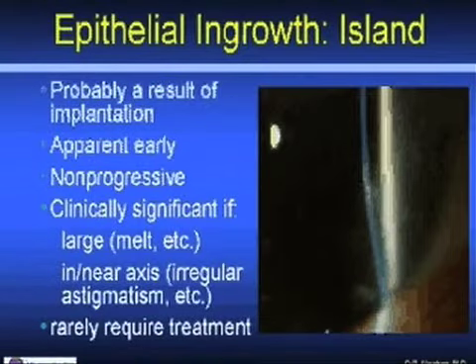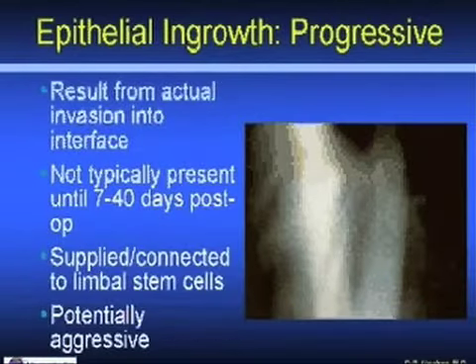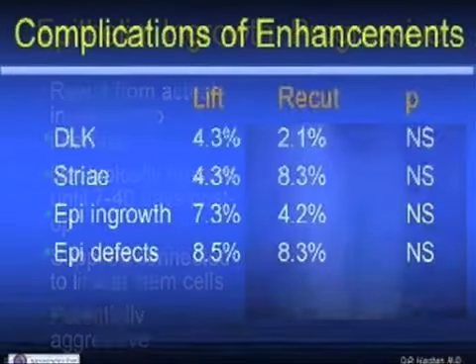Epithelial ingrowth, if we approach it early on, oftentimes is not much of a clinical problem, and again stays limited to the periphery in many patients and doesn't even require removal in some of those patients. In some, though, it's progressive and then eventually requires removal, and I tend to remove the epithelial ingrowth when it reaches the point that it encounters about a 7 millimeter optical zone. That way, if there is any tissue loss from the epithelial ingrowth, because it can oftentimes erode the back of the flap, it is still outside of the area that's responsible for the vast majority of the vision.